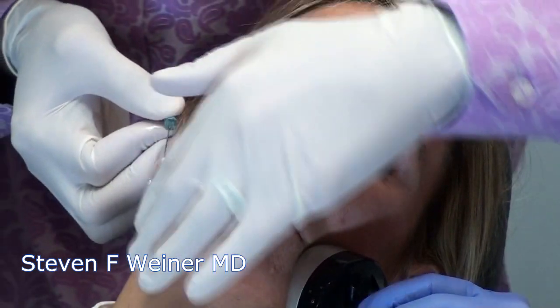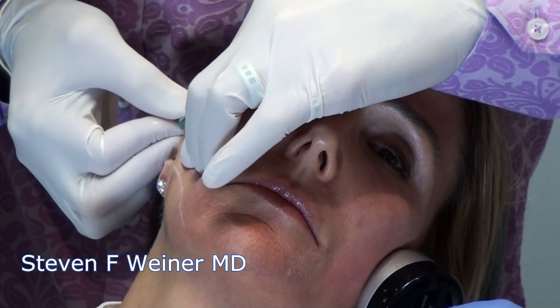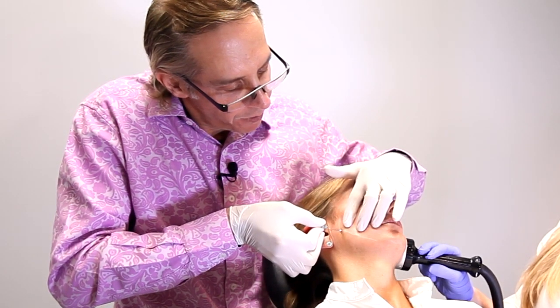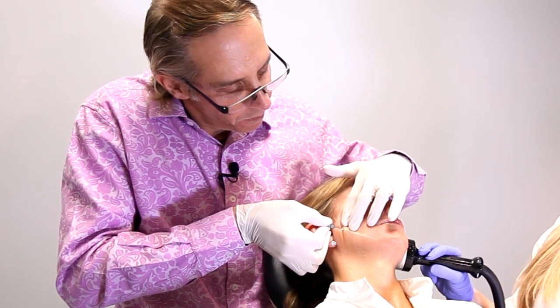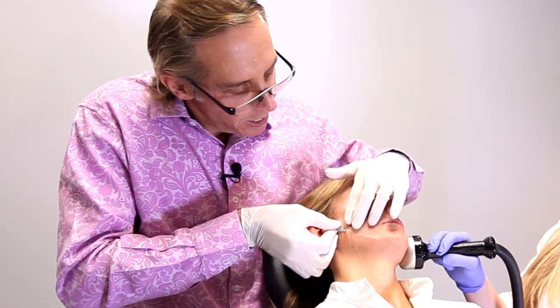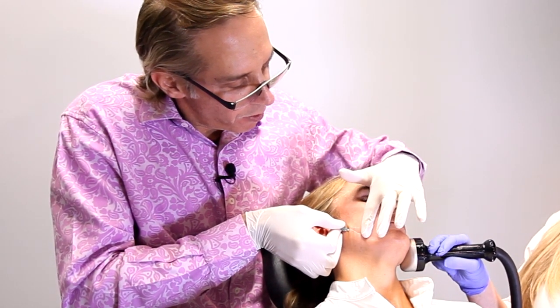and then you gradually milk it down the skin. See, she has very little discomfort here. And you take it to the marionette area. So that's placement.